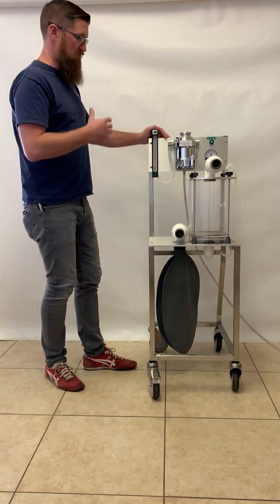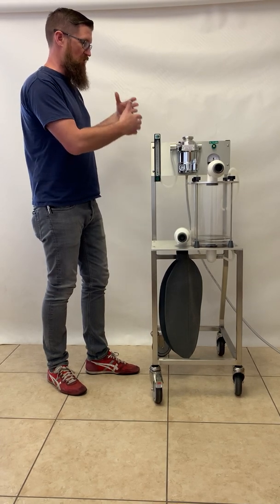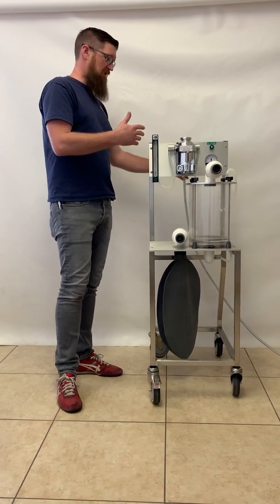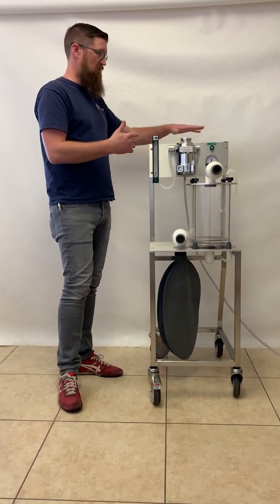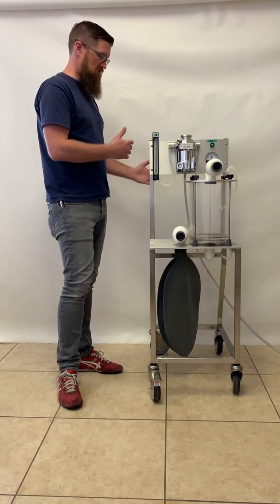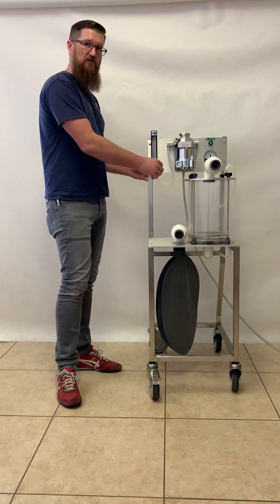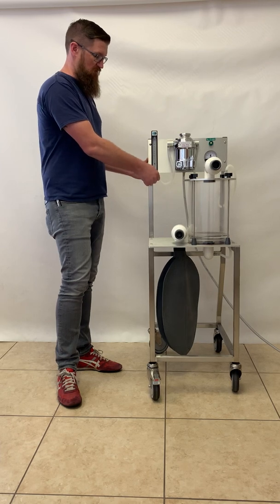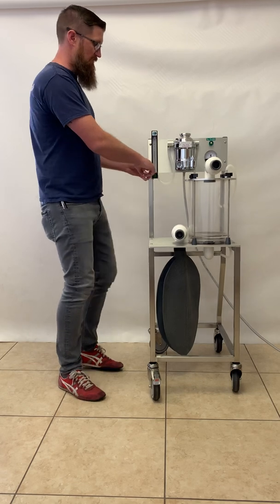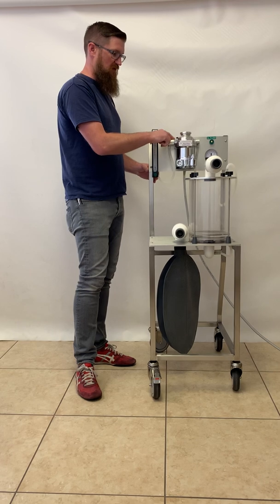We'll first start off with the basic flow and go along with the components along the way. We have an oxygen inlet in the back that distributes oxygen to the flow meter and the flush. The gas comes into the flow meter, and the flow is adjusted from 0 to 10 liters per minute using the flow meter knob. You set your flow rate according to the animal that you have, and the oxygen will flow through the flow meter and into the vaporizer.